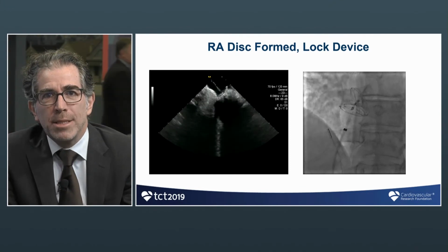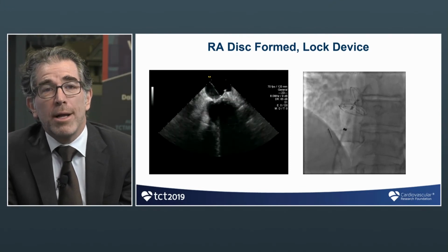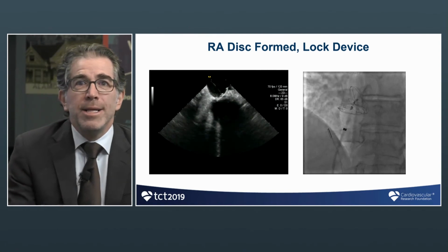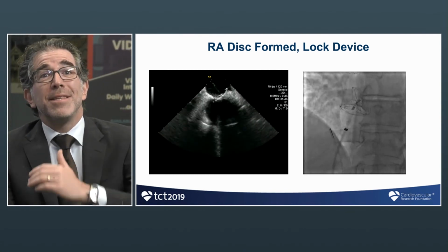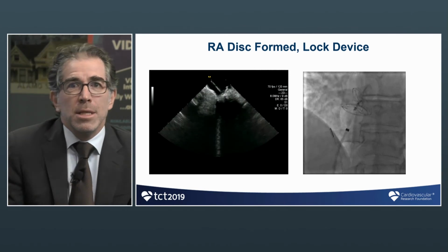So here we have a very nice grasp of the septum secundum, and you see now the lock on the right side. In fact, the device hardly moves at all with the lock. This shows you how well nestled it is in there. Yes. You see two things. You see the concavity of the left disc, and you also see some concavity of the right disc as well. So we have a nice snug effect.